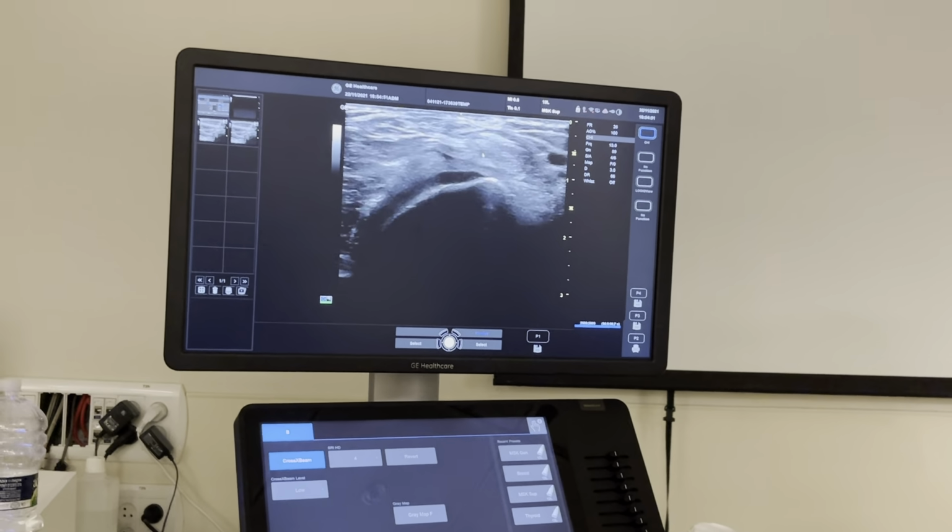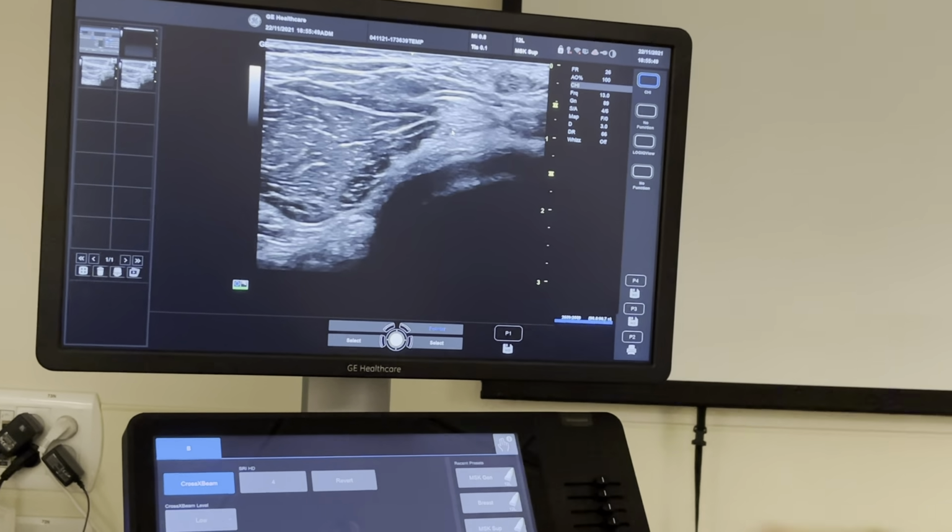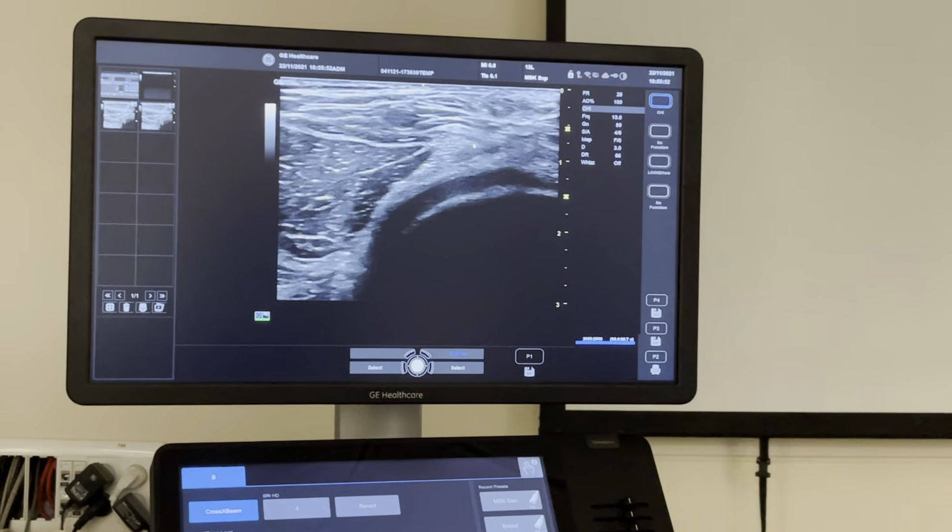The problem is with a lot of your patients that you're going to be scanning, it's not going to be as pretty as this. So let's see, what else do we see? We have the tendons on the right, and then here we have the big muscle belly that we see right here. That's the muscle belly of the medial head of the gastrocnemius. The medial head of the gastrocnemius has its tendon or its aponeurosis very much on the medial side right there. So if I point here, this here is the tendon or the aponeurosis of the medial head of the gastrocnemius. You can see it's a very nice hyperechoic structure, and it looks a bit like a moon shape or a C or a reverse C shape in this case, and we see the tendon right there.